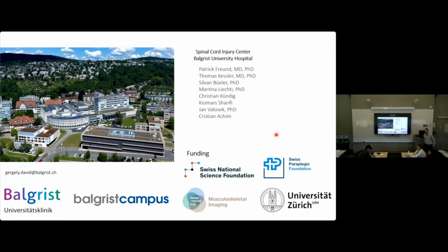Thank you, Gergely. Very instructive. About the processing and more specifically the segmentation of the gradient echo EPI, have you considered not segmenting it and just relying on the registration to the anatomical multi-echo GRE? So basically we would register it to the PAM50 template, to the multi-echo GRE of the PAM50 template, and then the multi-echo GRE to the PAM50. Yes. So basically that's how we segmented the spinal cord. We segment the spinal cord on the anatomical image and register it to the EPI.